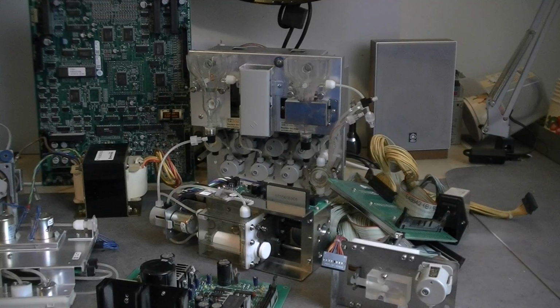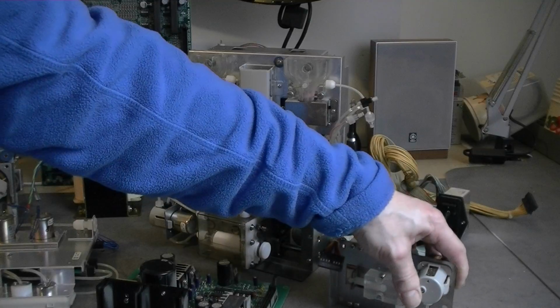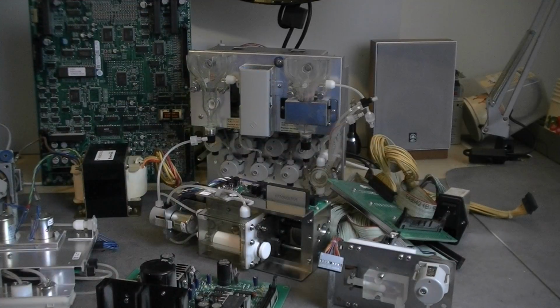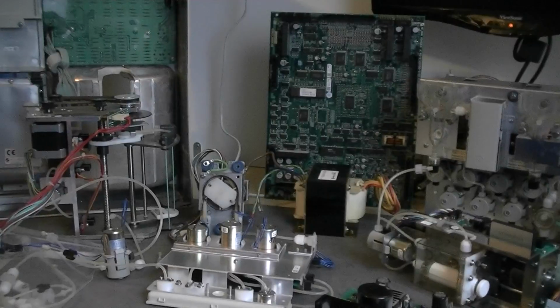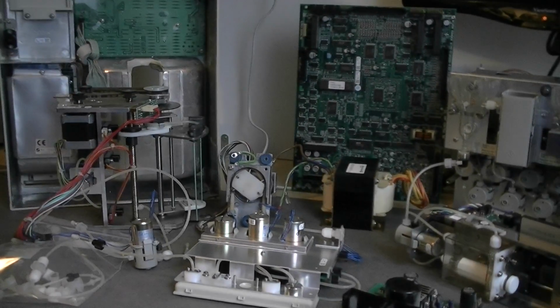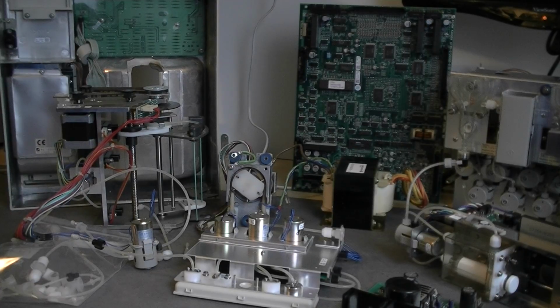Okay, so you can see a lot of pipes, lots of valves, pumps. Well, one pump actually, and many valves. So we will have a detailed look at everything in the few upcoming videos. Maybe after I will make one combination video with everything together, if you prefer to have a long video, but for me it is much easier for the workflow to make several smaller videos for such a complicated device that takes space and time to process.